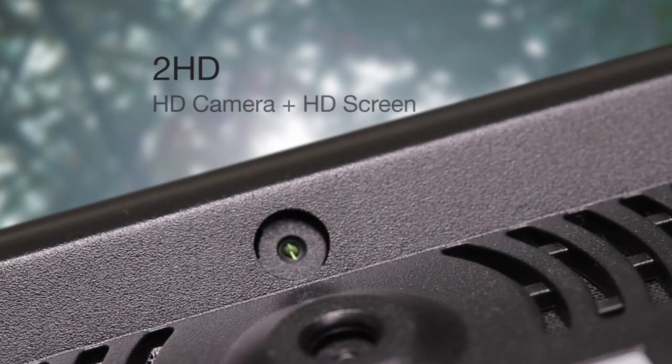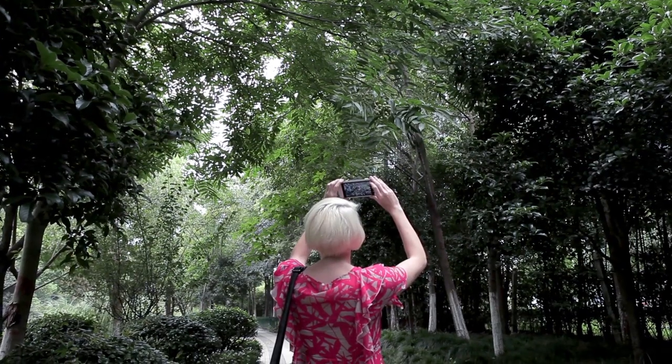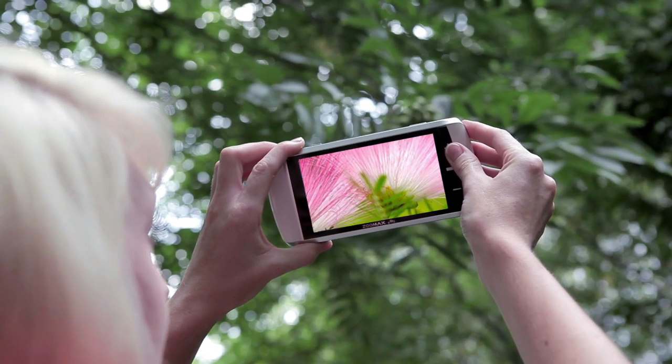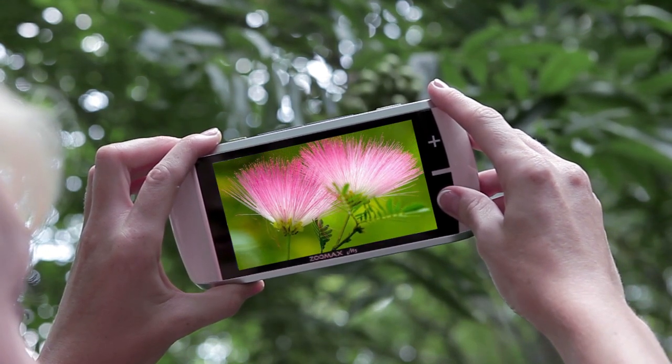It is the first 2HD handheld electronic magnifier. The two 5 megapixel cameras on the device provide crystal clear images and allow me to view long distance. The unique design of Touchstream combined with intuitive buttons light up my life.